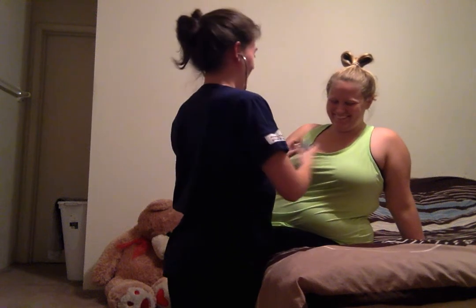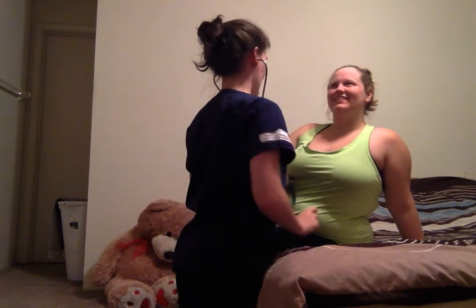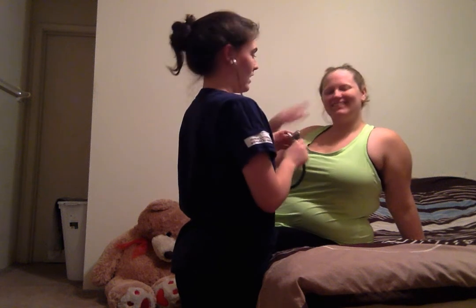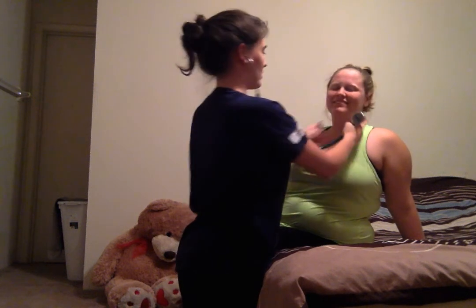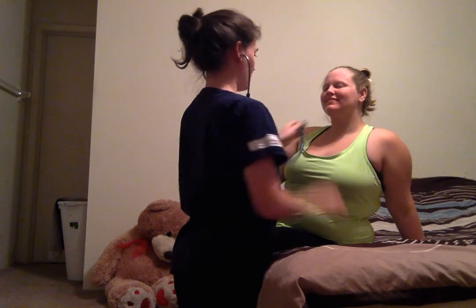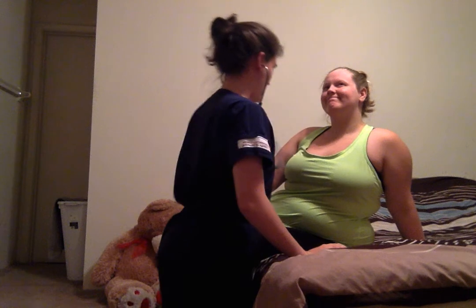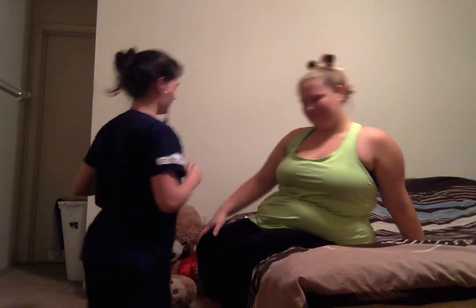Almost did it again. And then I would go over and listen for bruits. I don't hear any bruits. I'm going to go ahead and feel her other side of her carotid that I didn't do, and then listen for bruits too. Don't hear anything, so I'm going to do the back now.